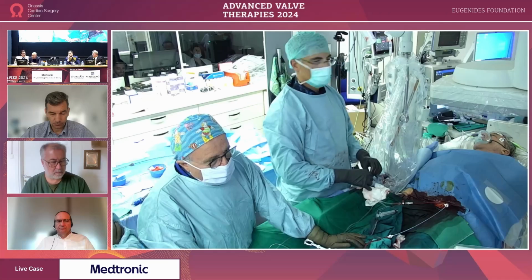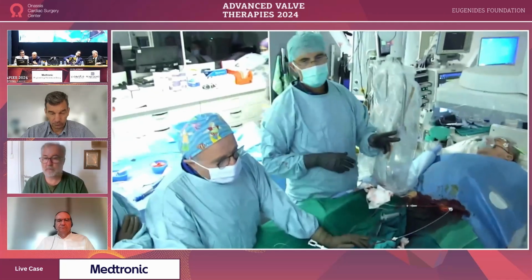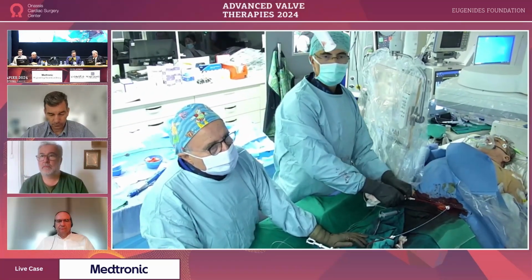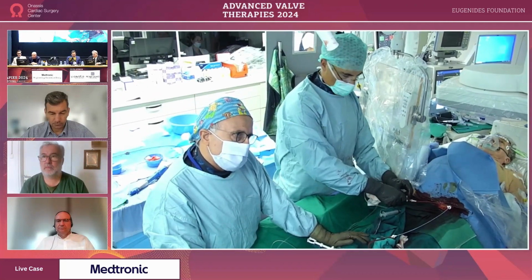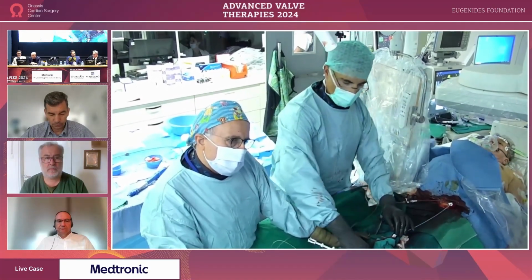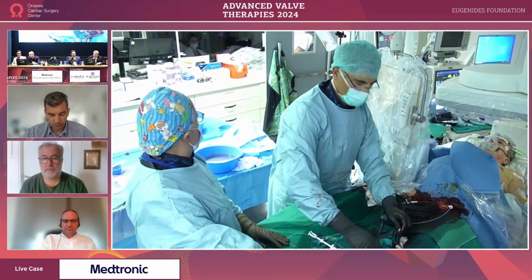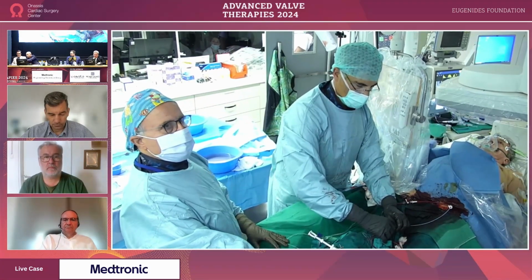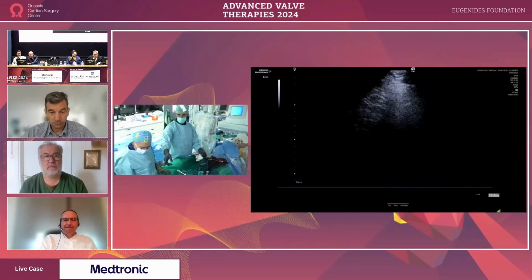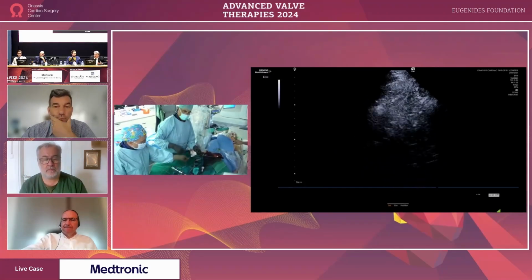I think that the AI looks like mild, at least, and I don't think there is any risk of post-dilatation. So if you are hesitating whether to do or not, I would. But I don't know the patient. It should be better also to wait a little bit because nitinol enlarged.